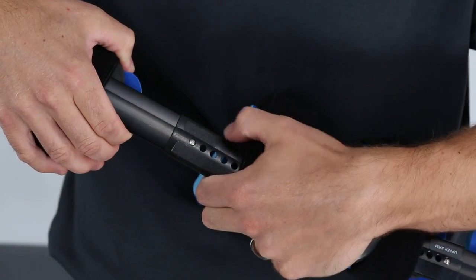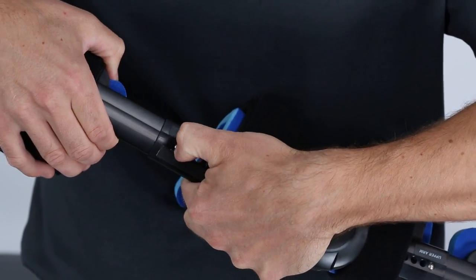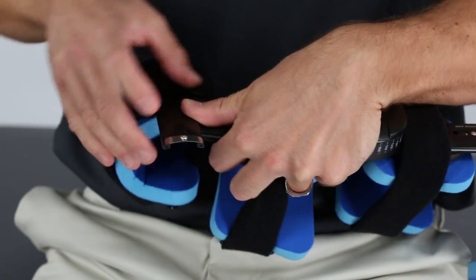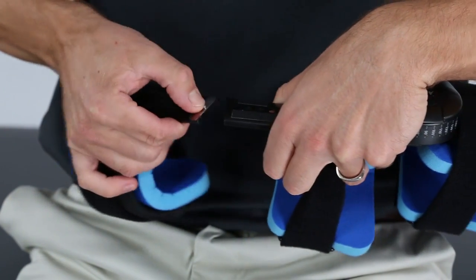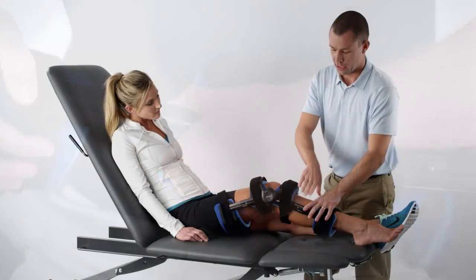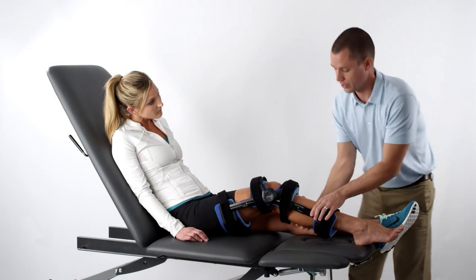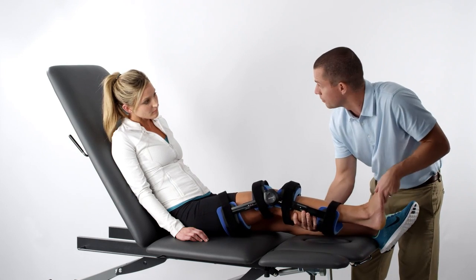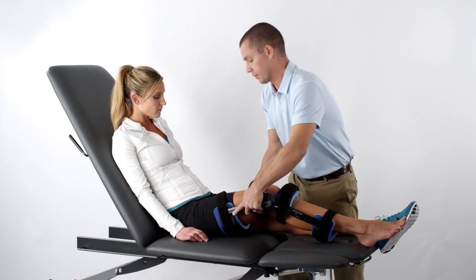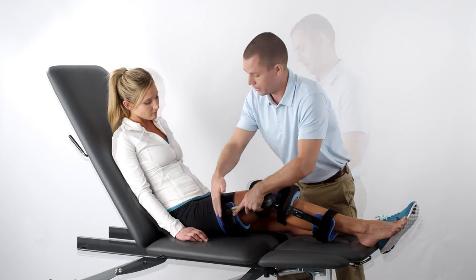Note that extending the strut length beyond the last adjustment hole may cause the leaf pin to fall out of the strut. If this happens, reinsert the leaf pin into its housing and reconnect the two struts. The distal cuff should be set at a length that does not restrict ankle motion. The proximal strut should not impinge on the medial thigh tissue.